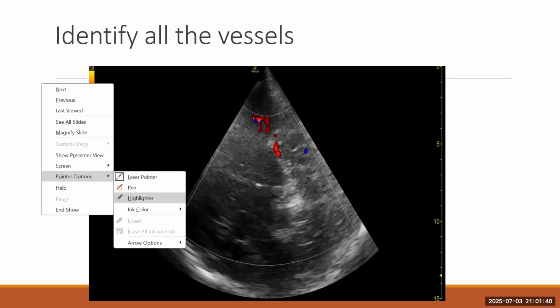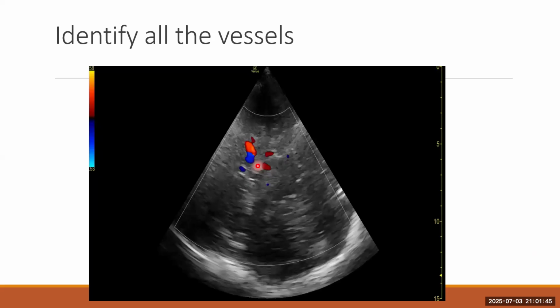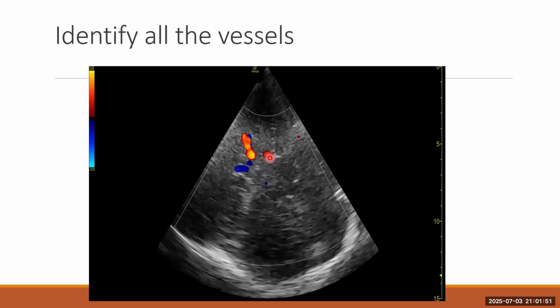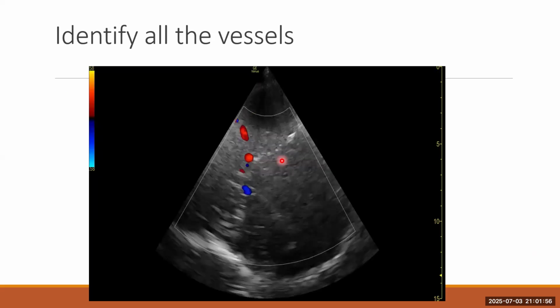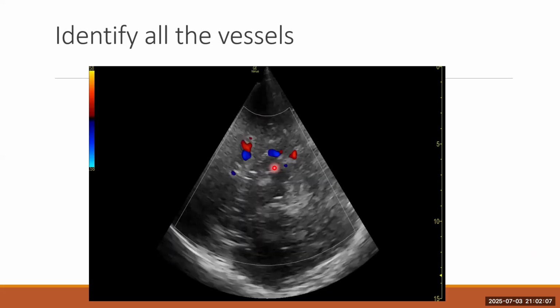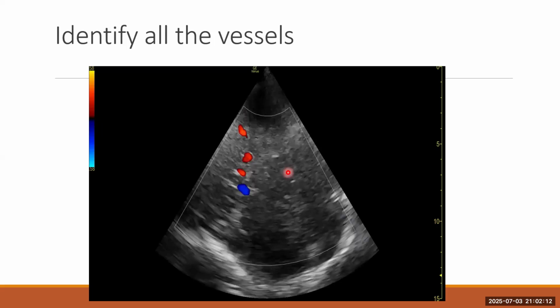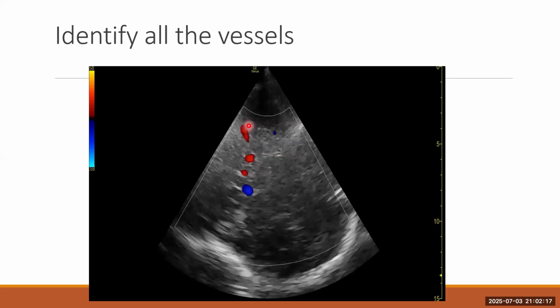Second. As we can see here, this is the MCA, this is the ACA, this is the P1, this is the P1 coming towards, this is the P2. Here we can see some red signals coming out from the P2 segment. Possibly these are all posterior choroidal arteries, which we might tend to get confused with the middle cerebral arteries. So we need to differentiate the vessels coming out.